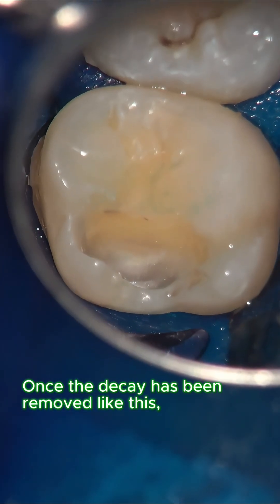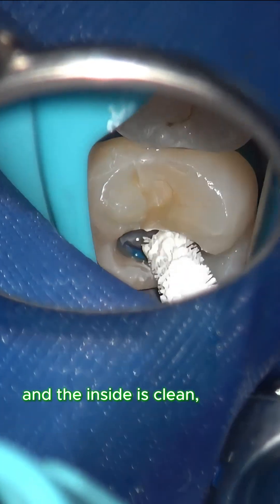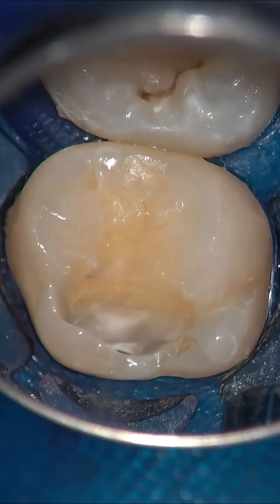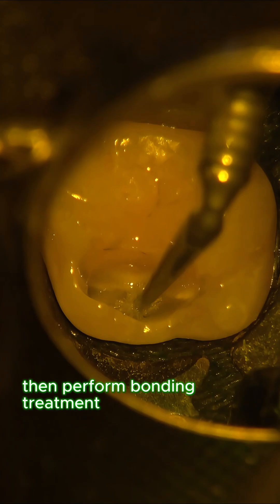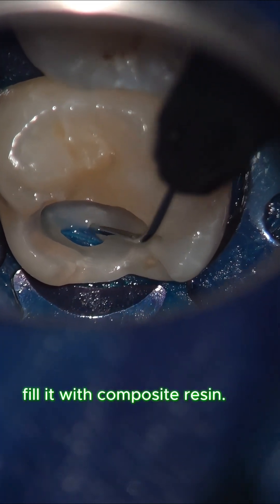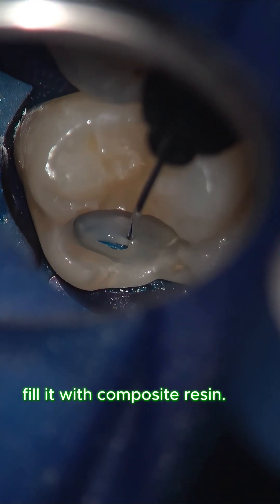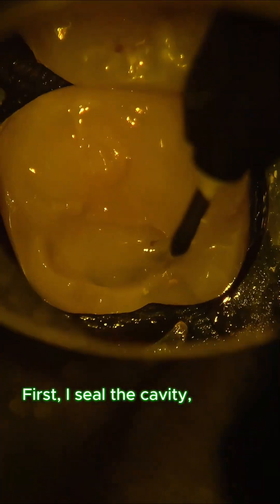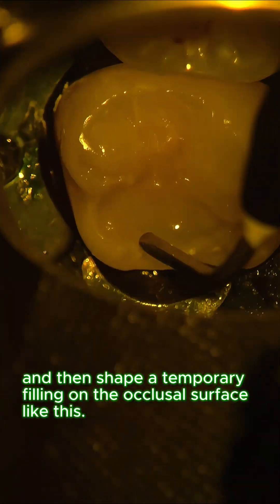Once the decay has been removed and the inside is clean, I apply an apatite coating to the dentin, then perform bonding treatment and gradually fill the cavity with composite resin.